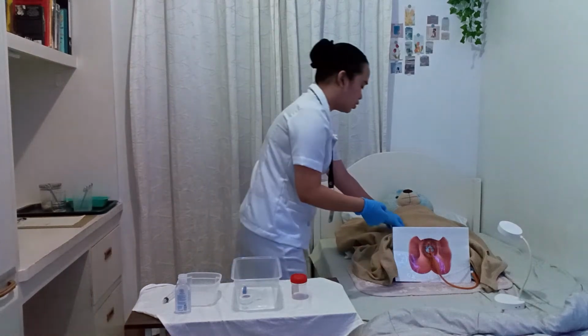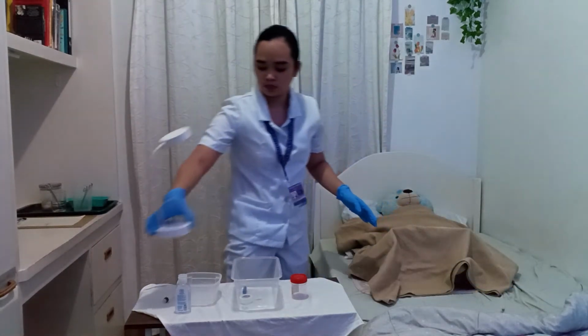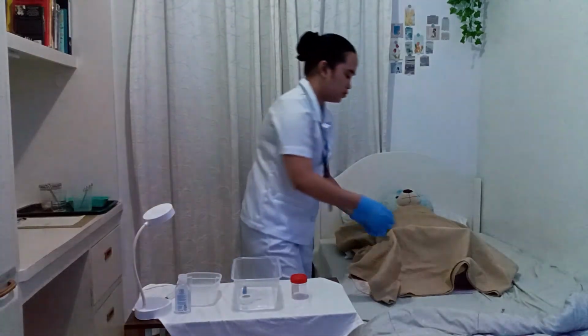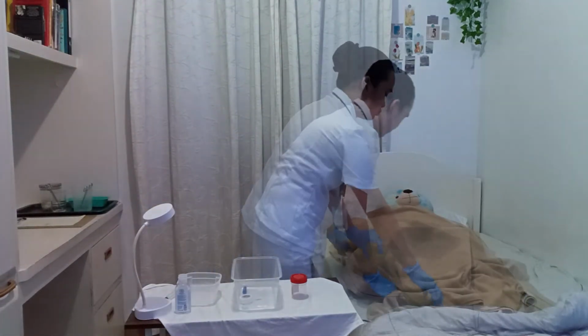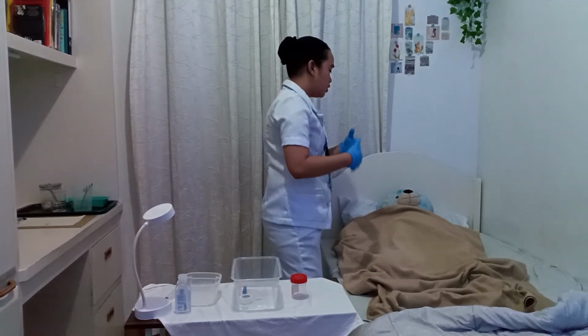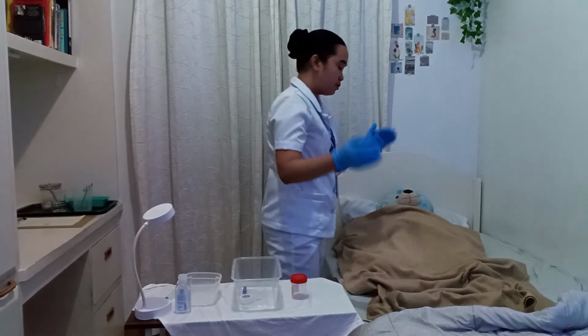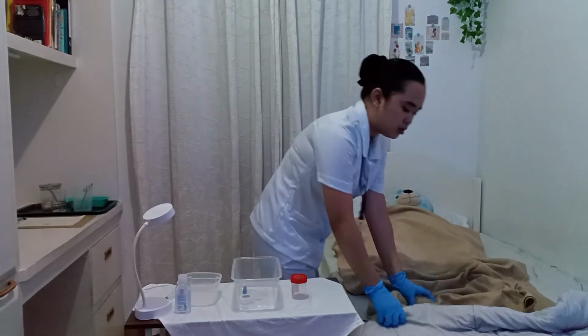Okay, I'm going to cover up the patient. Okay, ma'am, we are now done. So I'm now going to remove your bath blanket and I'm going to cover you up with your blanket, okay?